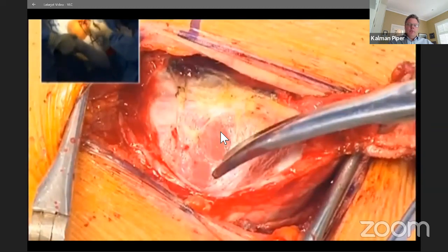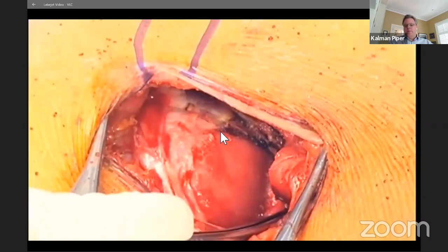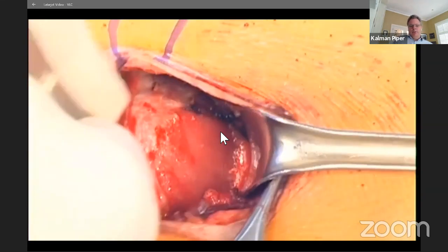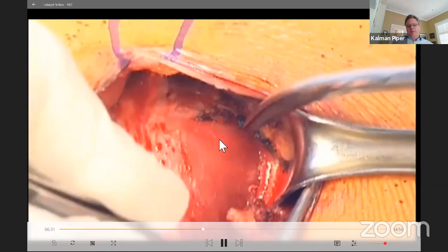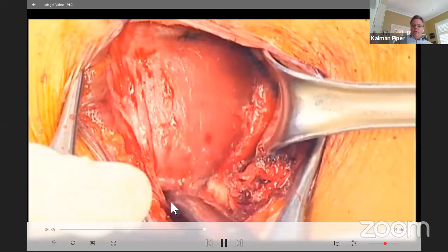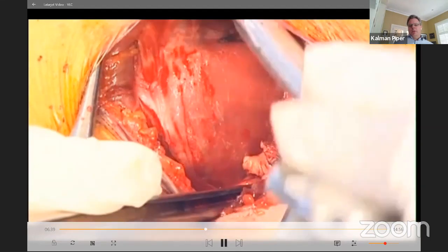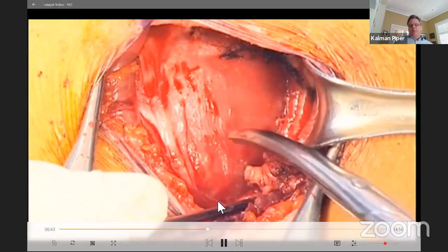And the tip that I was taught is if it doesn't look like muscle, or if it doesn't look like tendon, there's still clavipectoral fascia sitting on top. So continue your dissection until you see a nice clear muscle belly of the subscapularis. With the arm in about 30 degrees of external rotation, you expose a nice portion of the muscle belly, and you can clearly identify the superior and inferior border of the subscapularis.